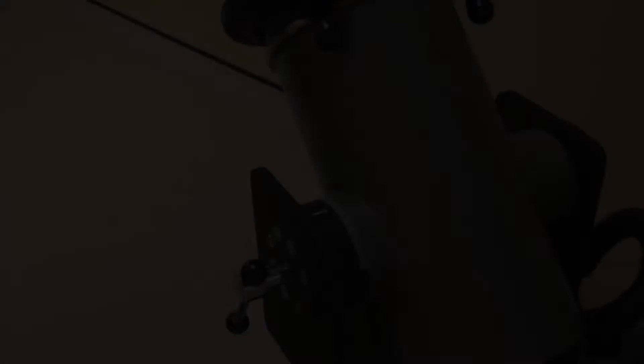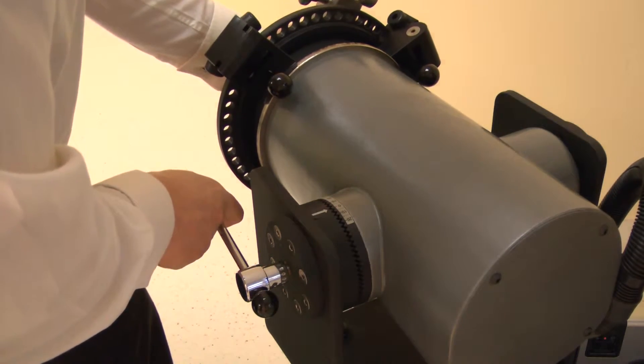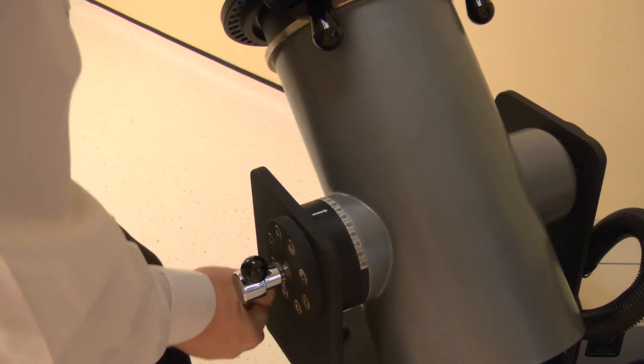Now set the dynamometer tilt. Release the locking handle then change. Adjust the tilt angle to 45 degrees. Lock by tightening the handle.